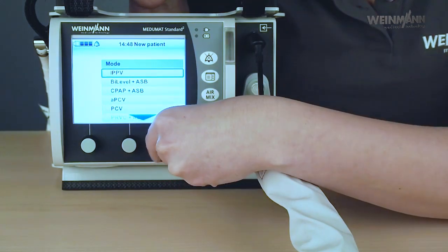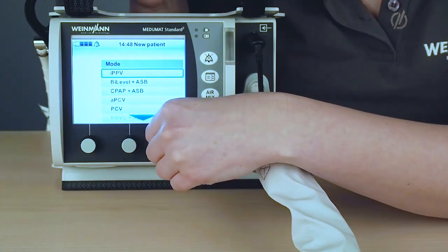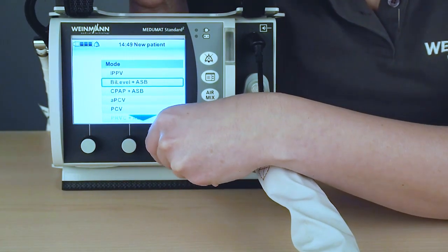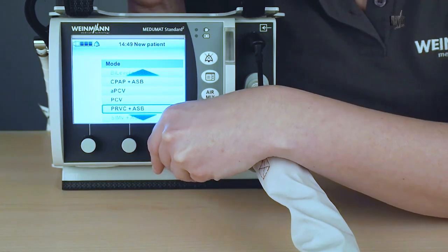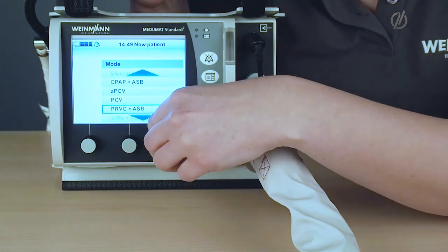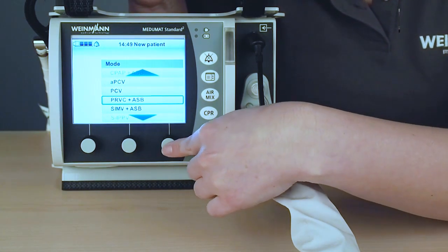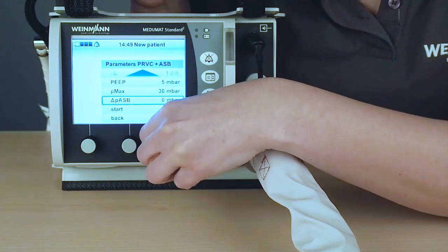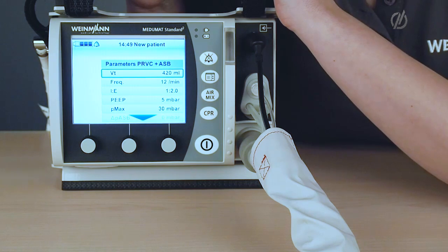I go to next. Here I can choose my ventilation mode now. So I have the possibility to choose from different ventilation modes. So for example, IPPV, which is a volume controlled ventilation mode, bi-level ASB, or a CPAP ASB. Pressure controlled ventilation modes are optional. So of course, only if the option is installed on the device, you can choose from these modes. In this case now, I will choose PRVC. This is a pressure-controlled ventilation where you can set also a tidal volume. So here now the tidal volume is automatically calculated by the height of the patient.